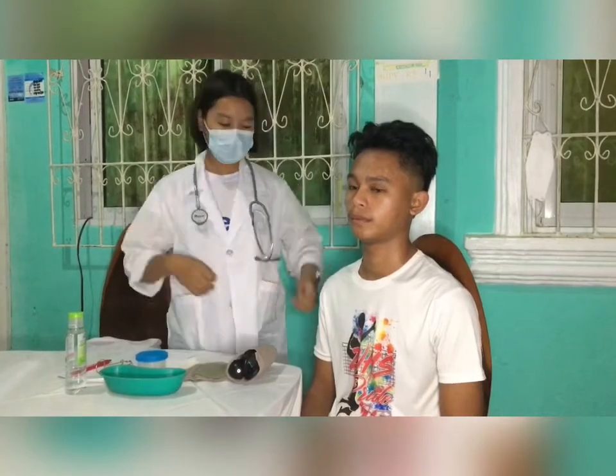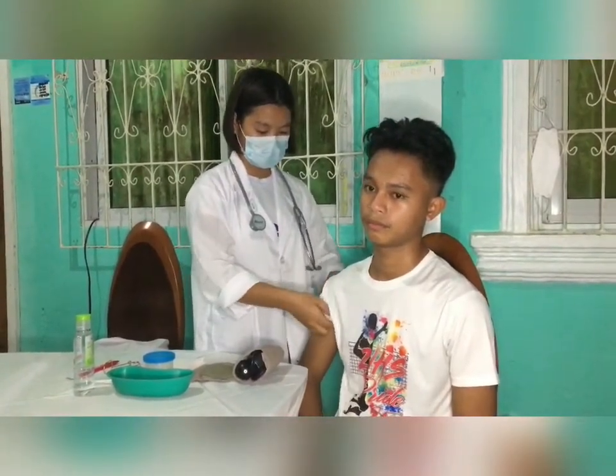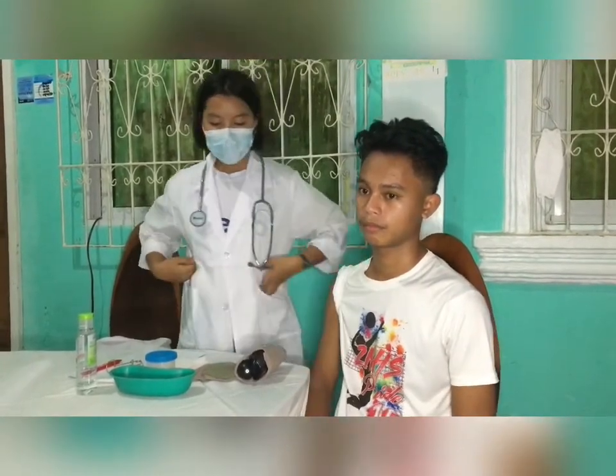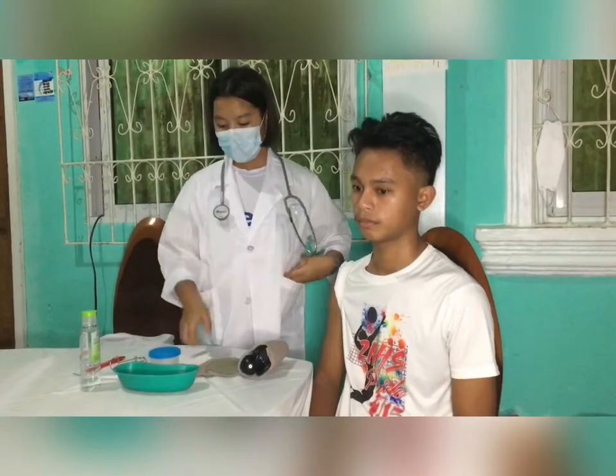Expose the patient's axilla by securely folding the client's shirt sleeve or gown up to the deltoid region. If the axilla is moist, dry it with the patient's towel in a patting motion.